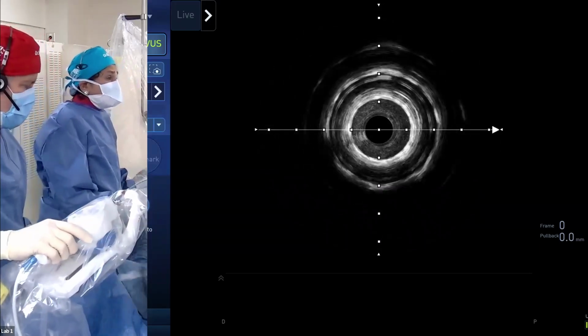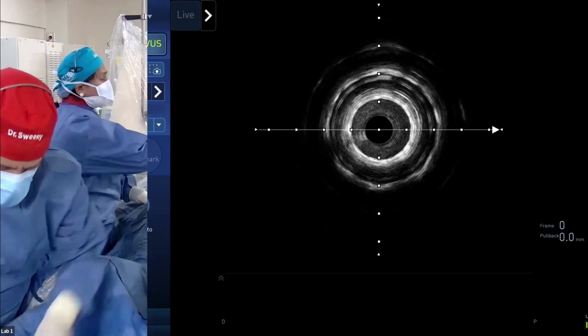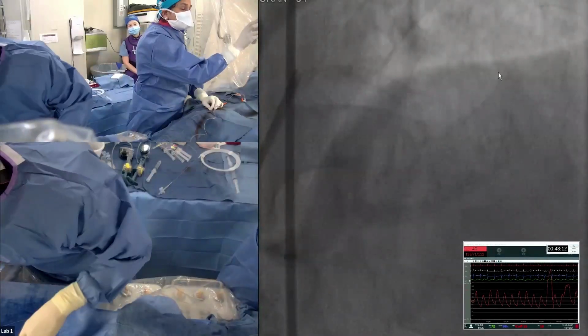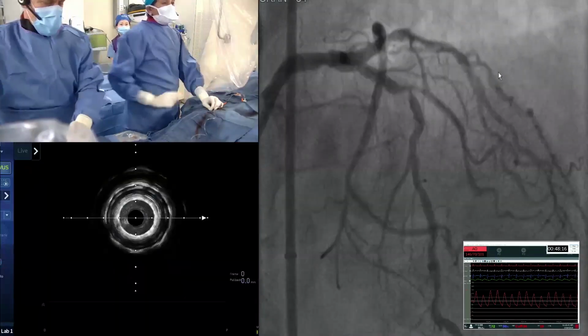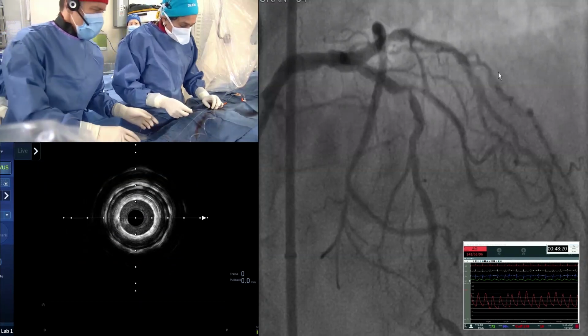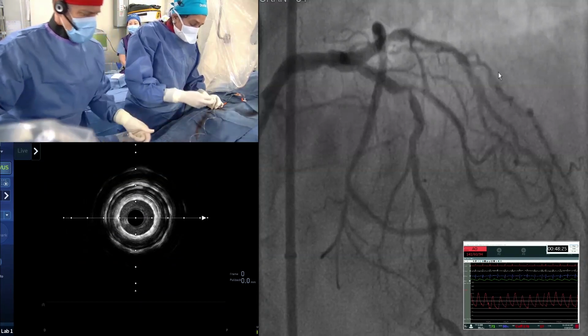And the way that I was having trouble, if you see the angiogram, let me go back. Can you put the angiogram on, please? Look at the 90-degree angle. I actually had the rota bar ready to go, but since everybody said IVUS, I tried, let's at least try. It would not go.